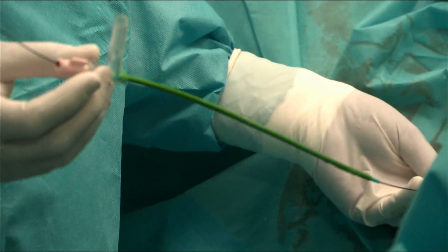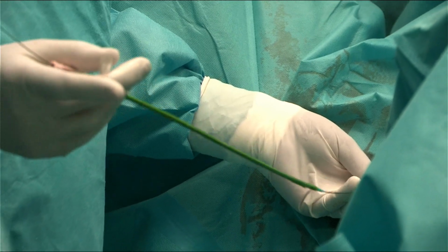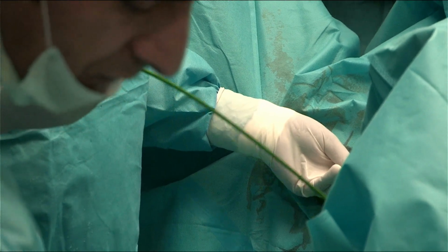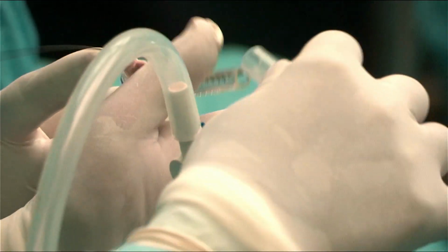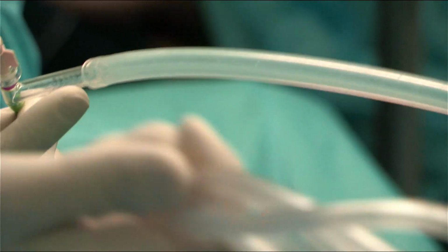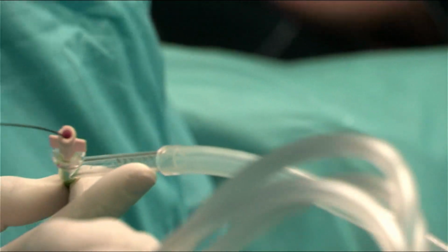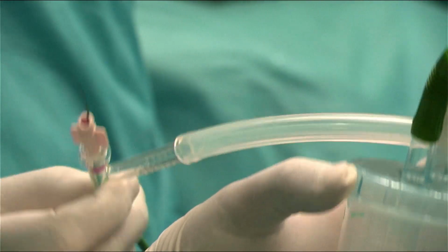It is 10 by 12. Here you can connect from here. Is there a separate channel for the suction or the same channel? No, sir, separate. Here is an adapter. Zoom in, we can't see. So this is an adapter here, which has a port for the guide wire as well as for the suction. So you connect it with the bottle, and then from the bottle you connect it to your own OT suction. Very nice. So whatever the fragments are, they will come out with that. Yeah, so this is the Ester sheath which I am using now.